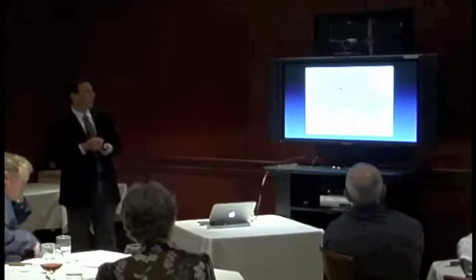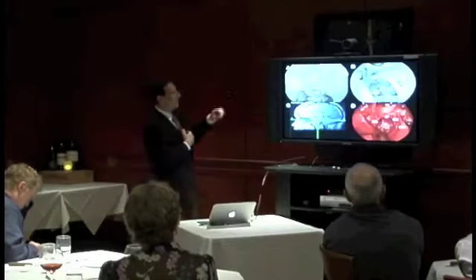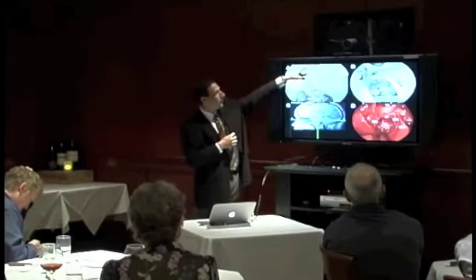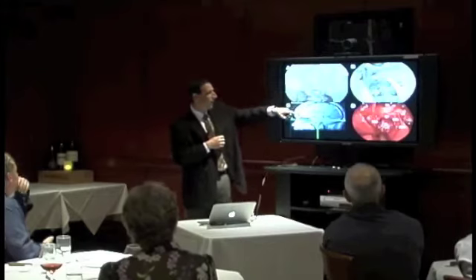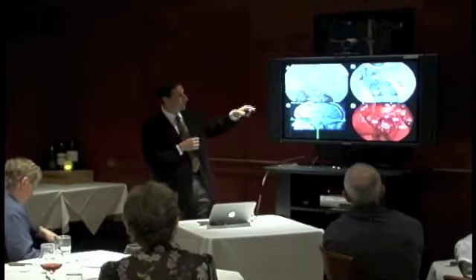So adjusting the endoscope and just coming a little bit down, we were able to do this. So here are the cadaver correlations. When we look lower down, here's the pituitary gland. We're now looking lower. This is the clivus. The carotid arteries are on either side. And this is the nasopharynx. And this is basically the infratemporal fossa.